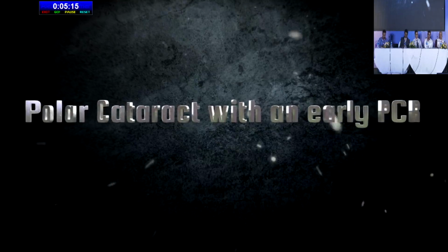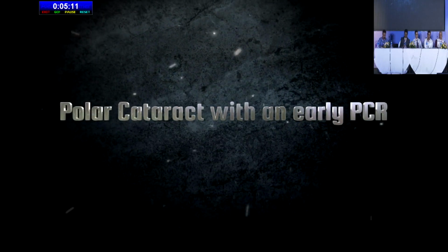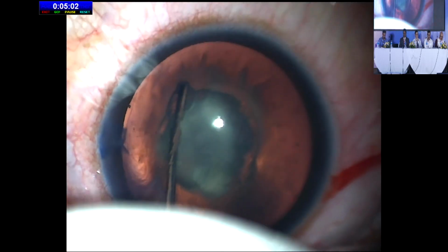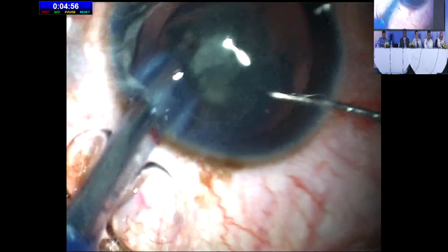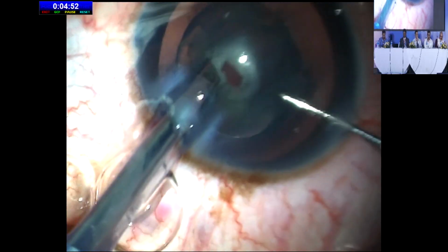The next case is a patient with a posterior polar cataract who ended up with a PCR very early on in the surgery. Here's a patient with a typical posterior polar cataract. Following the rhexis, we proceed to do a hydrodissection. A successful hydrodissection is performed, and then, without further manipulations, we proceed with the nucleus management. But look what happens as soon as I go in foot pedal 2. The posterior capsule gives way.